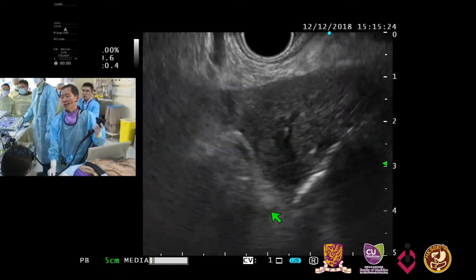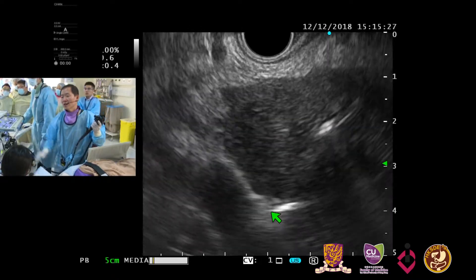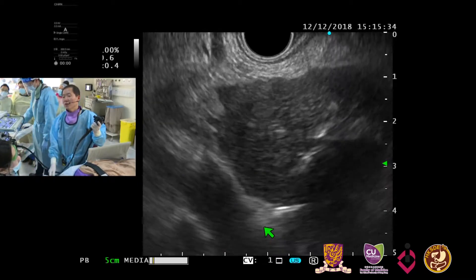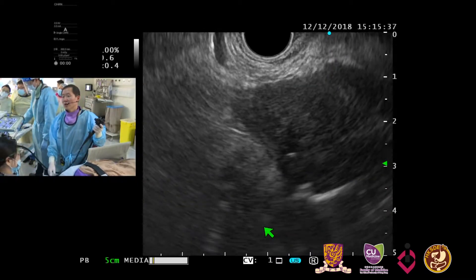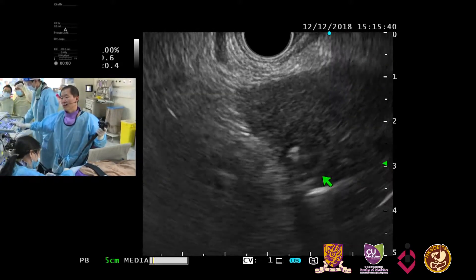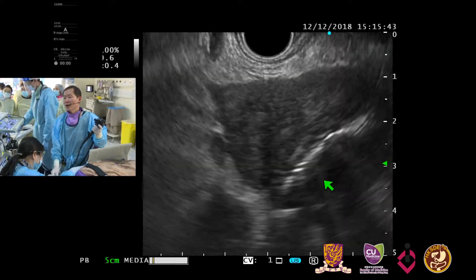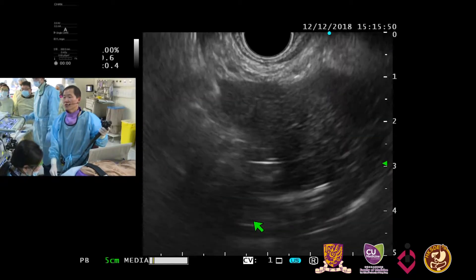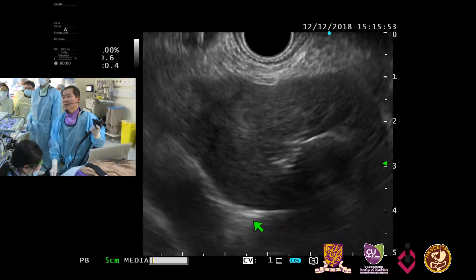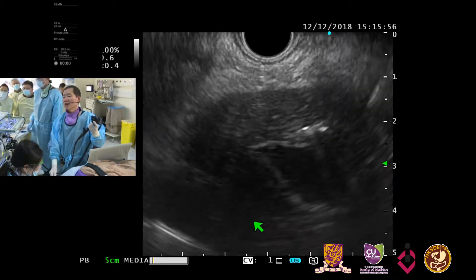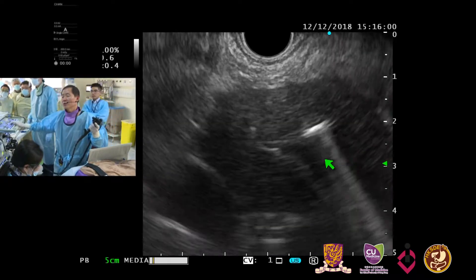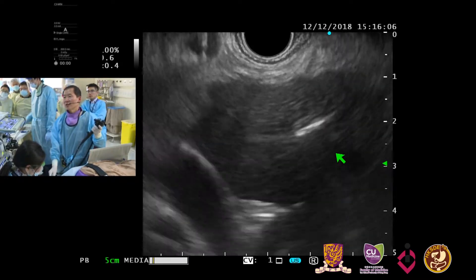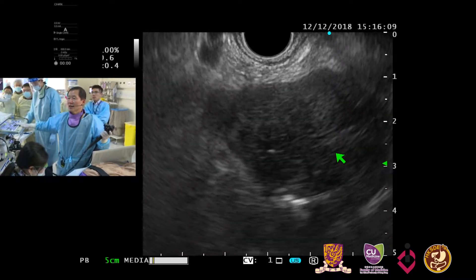In this case, they already resected the left lobe of the liver. If I rotate like this, we are looking at the main portal vein — the extrahepatic main portal vein and the right portal vein here. Generally, if I do counterclockwise rotation, we will see the left lobe portal vein, but in this case there is no left lobe. This is the left portal vein. If I rotate a little bit further, we may see the IVC. This portal vein–IVC line actually divides the S1 segment posteriorly — this is the margin.